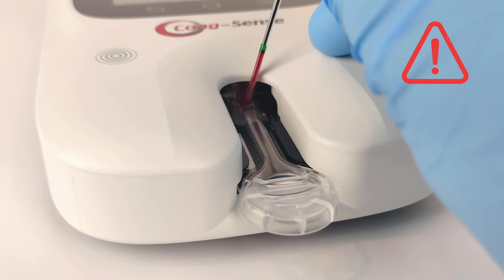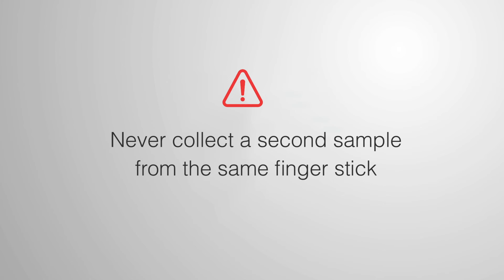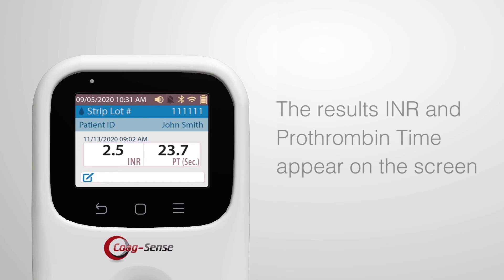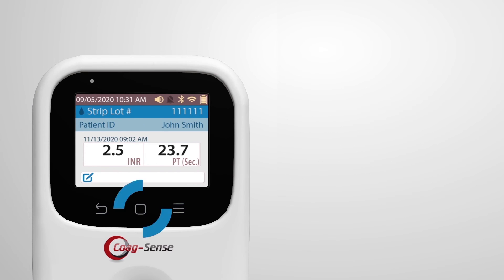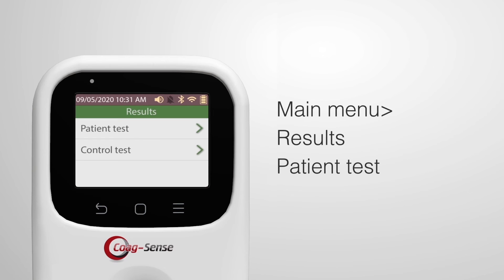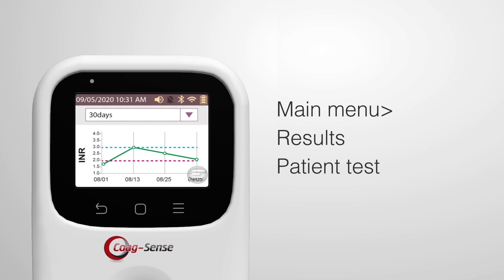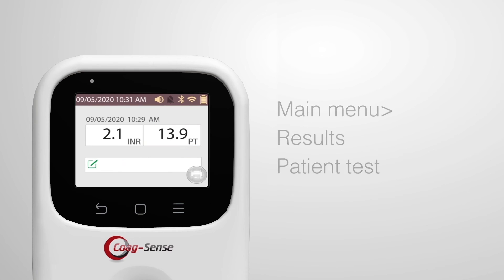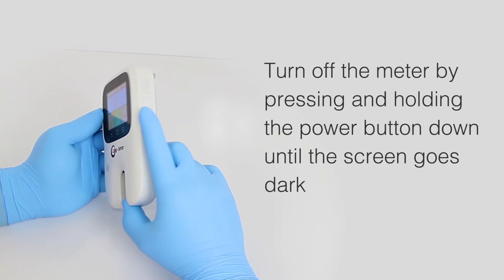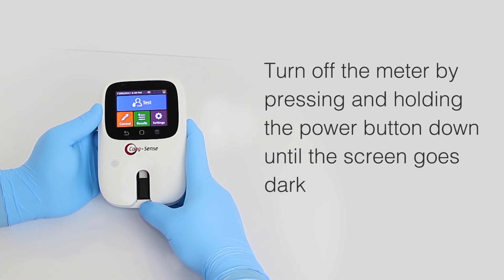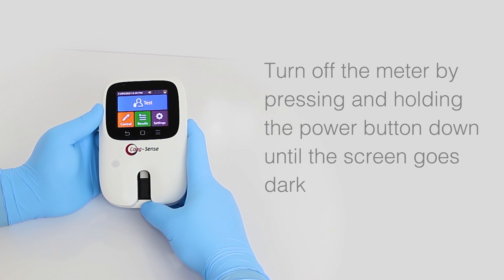Never add more blood to the test strip. Never collect a second sample from the same finger stick. When testing is complete, the results appear on the screen. The test result is recorded in memory and can be found on the main menu using Results and then Patient Test. Turn off the meter by pressing and holding the power button until the screen goes dark.